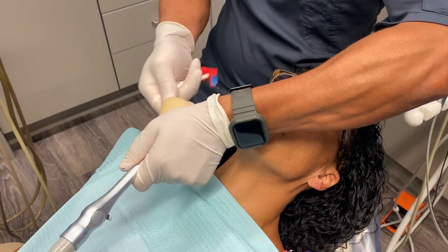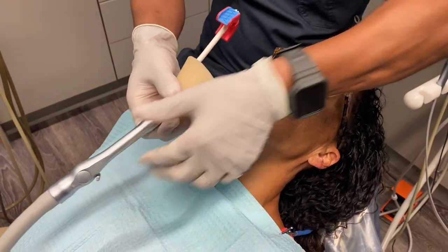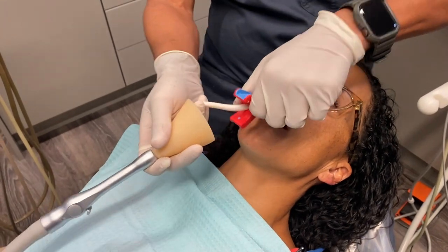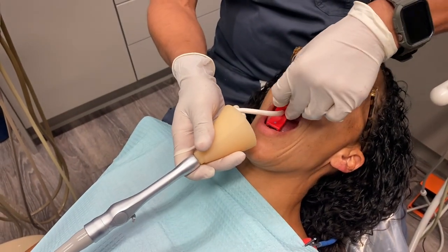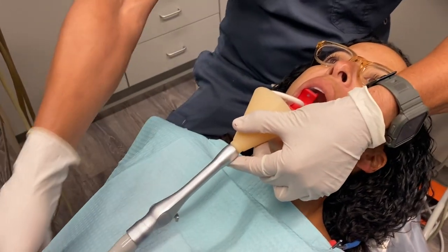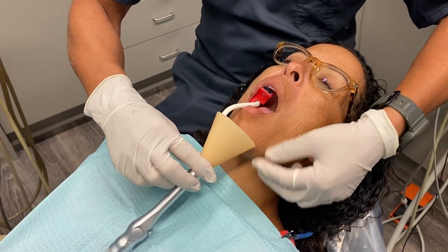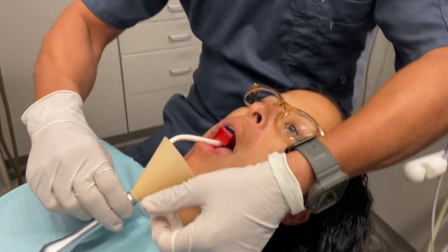Insert it. Again, you don't want to go deeper than two and a half inches to the midline. Right down — loosen your grip a little bit. But you can see it kind of puts you down a little bit, so it'll work for some people.